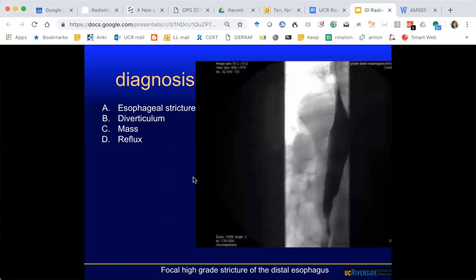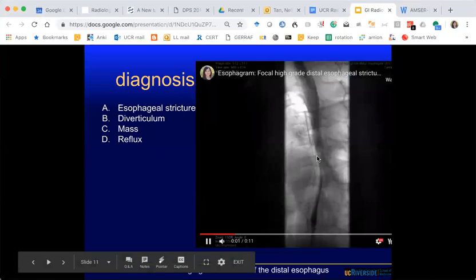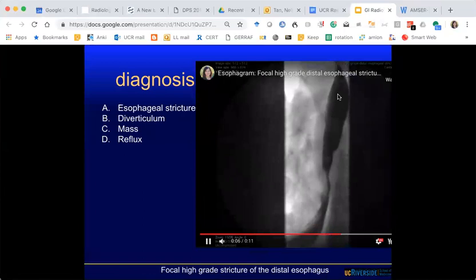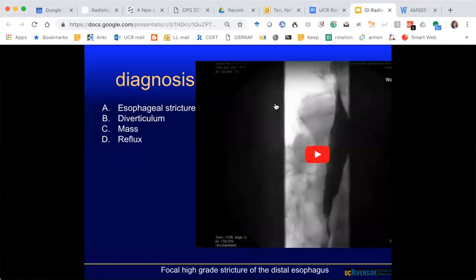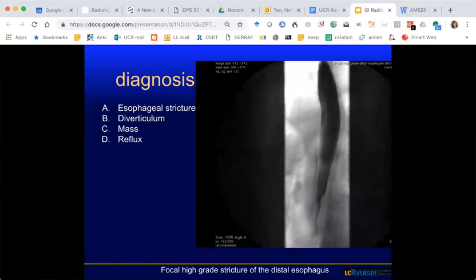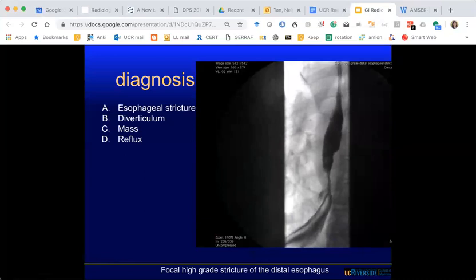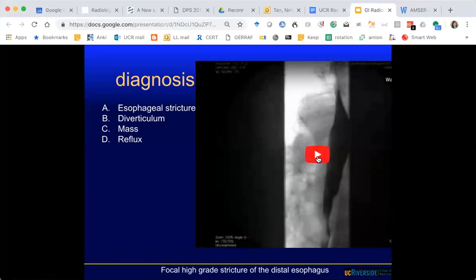Here is an esophagram — a motility study where the patient swallows and we get a CINE image. What do you see? Esophageal stricture, diverticulum, mass, or reflux? With an esophagram you can assess structural as well as functional disorders — structural things like strictures, diverticulums, and masses; functional things like reflux and reduced motility. Everyone thinks it's a stricture.